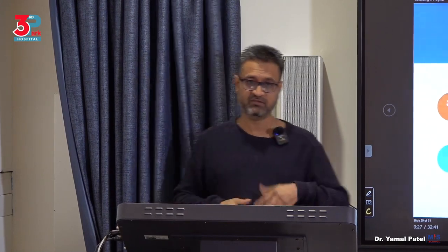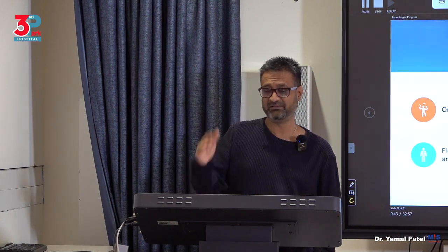Okay? It's a one-man show. So you have to be careful, everybody's watching you. All right? In laparoscopy, when something goes wrong, you can put it on the assistant and say, they were not helping me. In hysteroscopy, there is no assistant, it's you. So it's a one-man show. You mess up or you cause a complication, it's you.